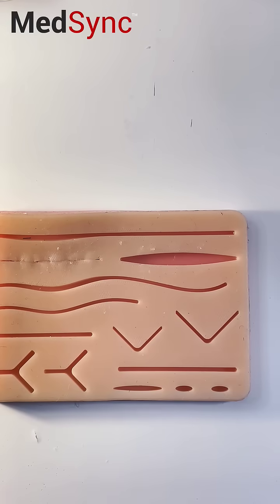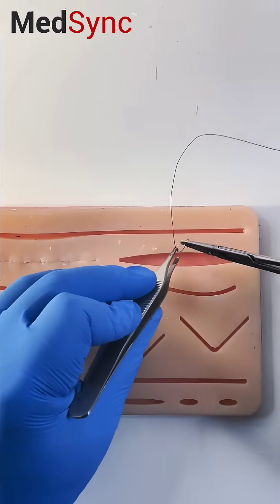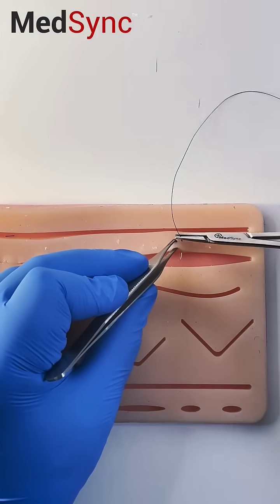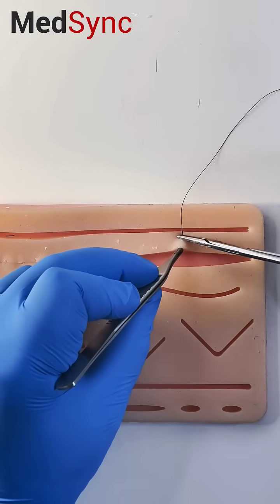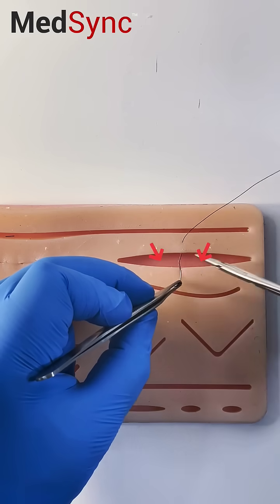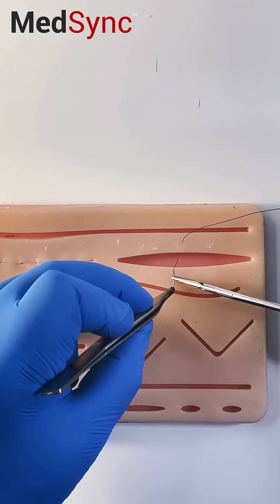This is the technique for the suturing pros. Watch this. You do an interrupted suture to take off the tension so you can put your deep dermals in between this gaping wound.